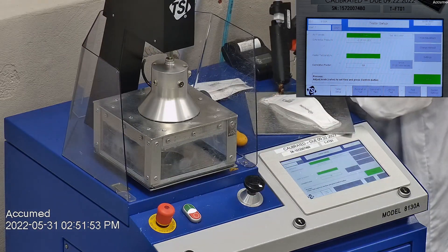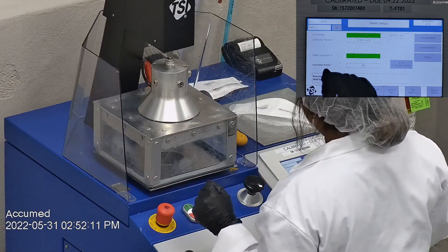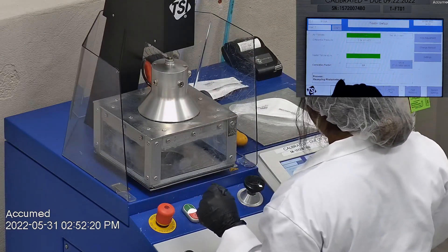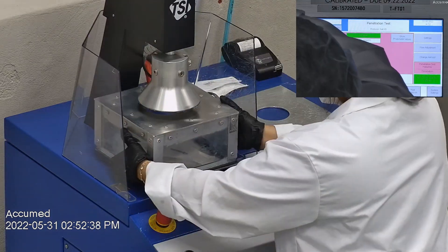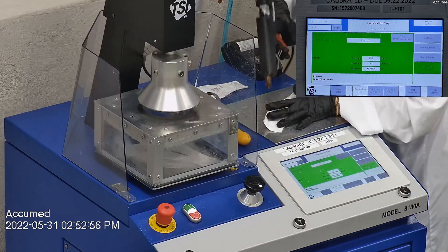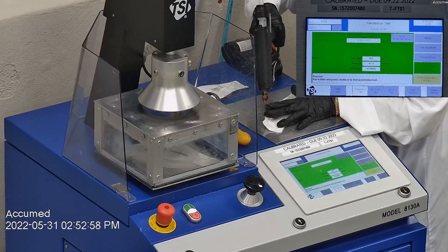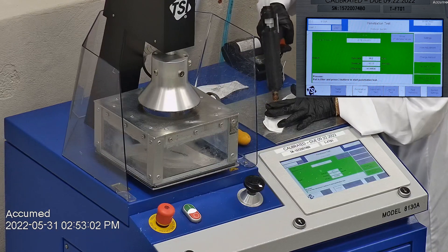The results are displayed on a TSI monitor. F stands for airflow rate, which we test at 85 liters per minute. R is for resistance, also referred to as pressure drop — this correlates with breathability, so the lower the number the more comfortable and breathable the mask is. E stands for filtration efficiency percentage. The first sample tested at 97.88% with a pressure drop of 11.2 millimeters of water.